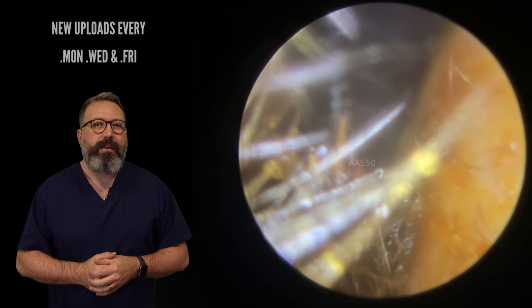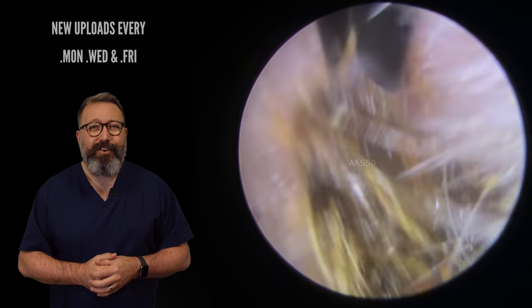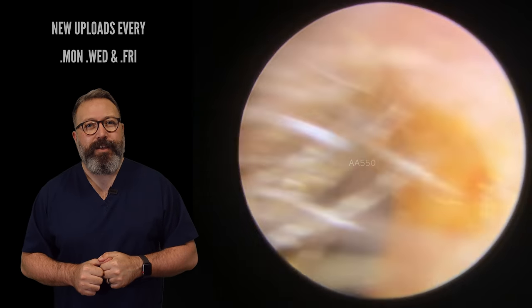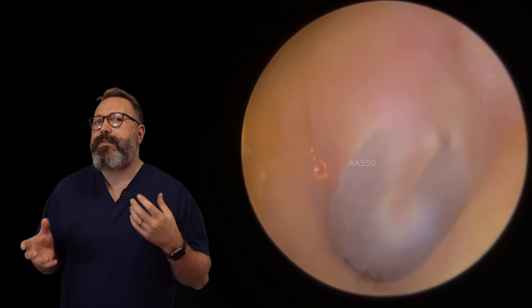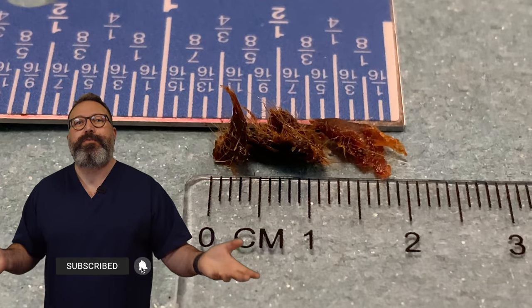Let's bring this out — there we go. You'll have a good look at this when it comes away. There we go — look at those little hairs, loads of them. They've got a little mini hedgehog in there — loads of little hairs all around the outside edge. And there we go — there's the eardrum looking a little bit on the dull side. There are a couple of tiny little flakes left at the bottom there. Two centimetres — easy read, three quarters of an inch. Really, really quite dense ones there.